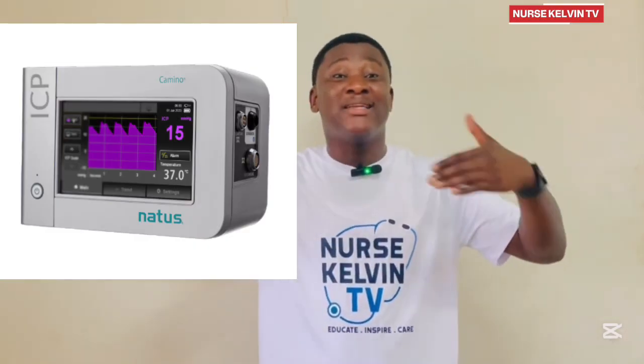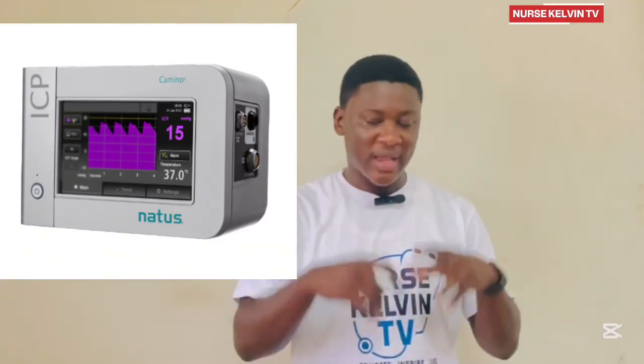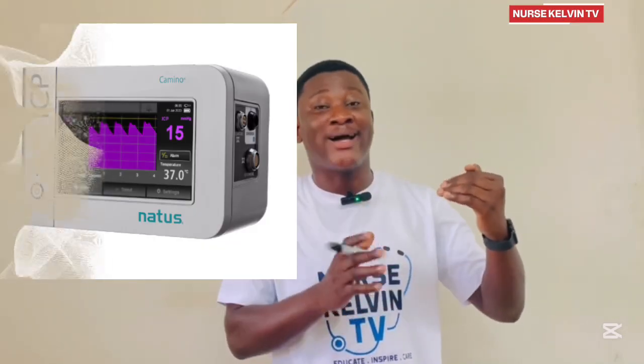Then the next one that we are going to talk about is the intracranial pressure monitor. This device is going to measure the pressure in the skull, into the subarachnoid space. So that's the work of the intracranial pressure device.